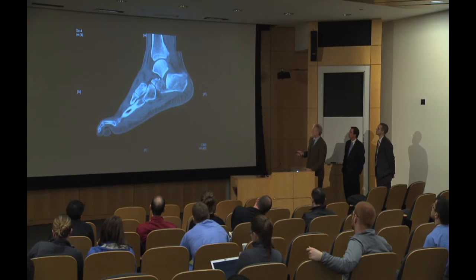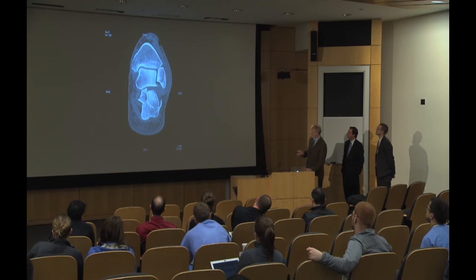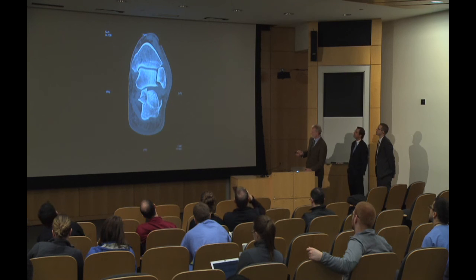The CT scan supports that the posterior facet is in a large piece as you scroll through it. The middle facet is not too terribly badly displaced. The comminution looks like it's more lateral. And on the coronal cuts, there's a pretty significant step-off that probably isn't ideally treated by non-operative means.